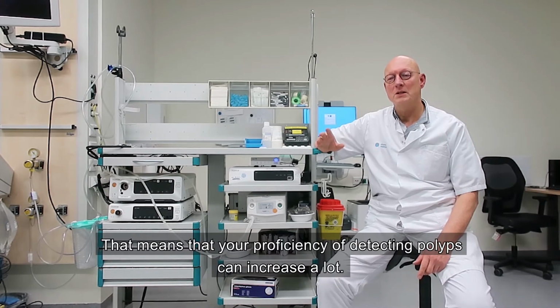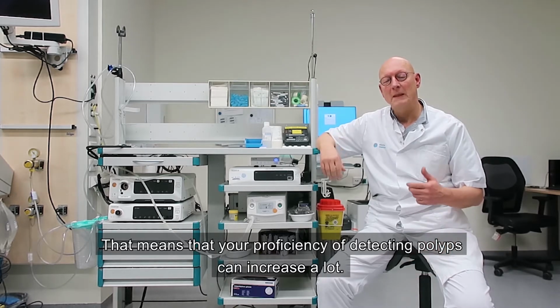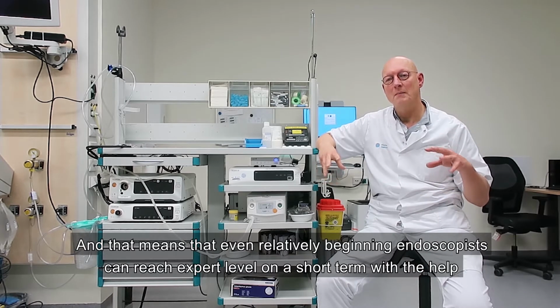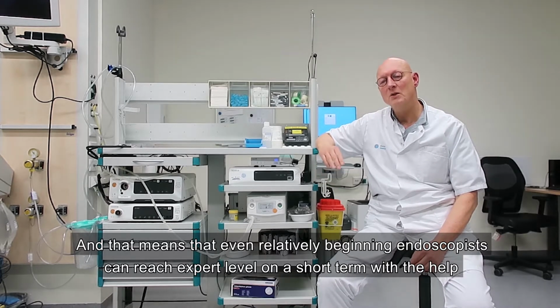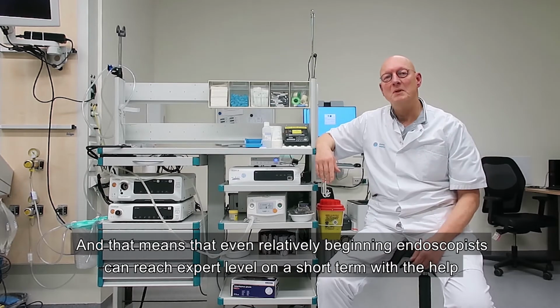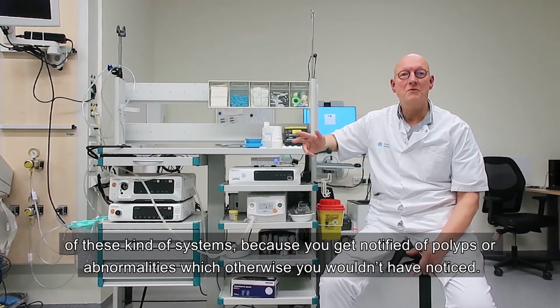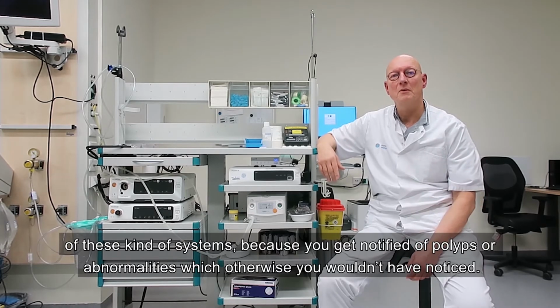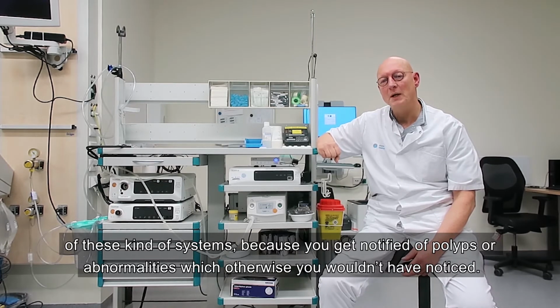That means your proficiency in detecting polyps can increase a lot, and even relatively beginning endoscopists can reach expert level in a short term with the help of these kinds of systems, because you get notified of polyps or abnormalities which you otherwise wouldn't have noticed.